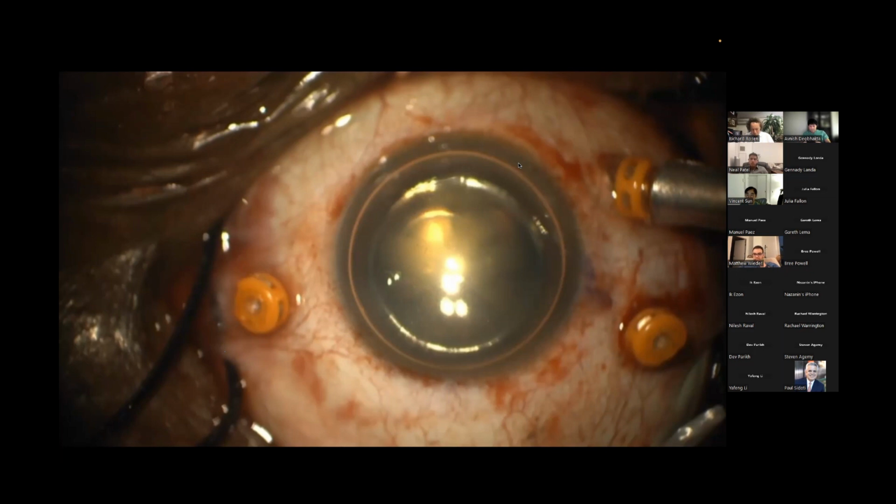So nobody really touched the lens. It's a good point, and I just opened this Pandora's box in terms of teaching points: I don't think the lens should be touched unless you cannot complete the surgery. Yeah, and it's a good point, Dr. Landa, because it's a tail risk event, like I like to say, but that's an iatrogenic one. You just start futzing around with the lens and then everything goes wrong with the retina. So it's a very good point to bring up.